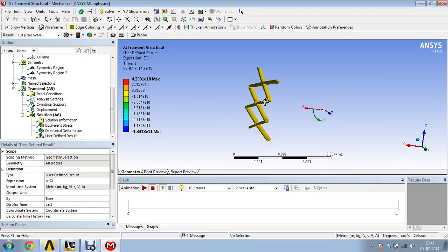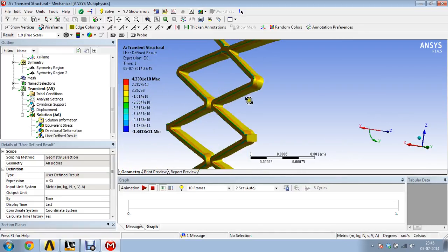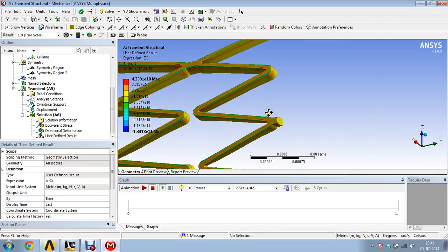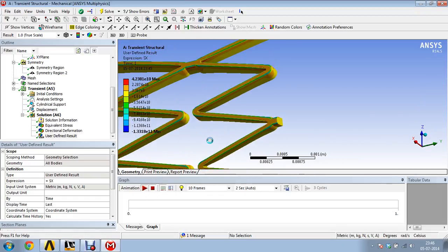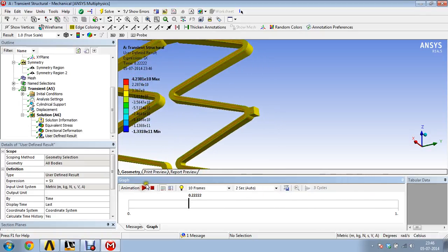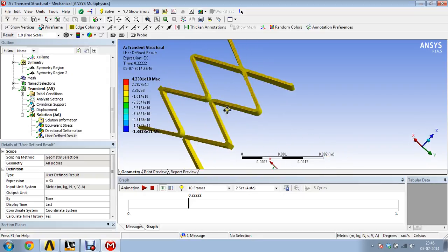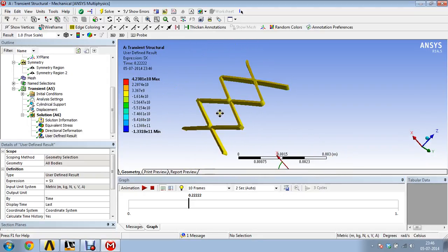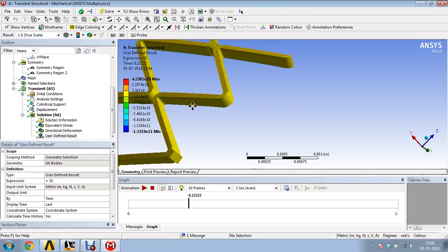So you can very much clearly see that throughout the thickness the radial stress is somewhat constant, and it only appears on this. Okay, so it is very clear that because it is a thin cylinder kind of geometry with spaces in these parts, there are constant stresses in the radial direction along the stent.